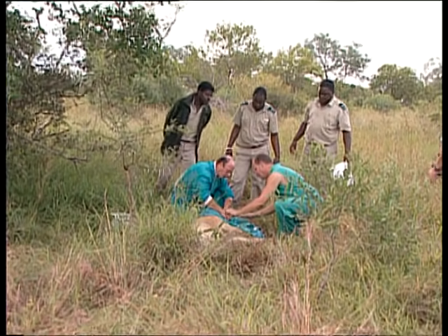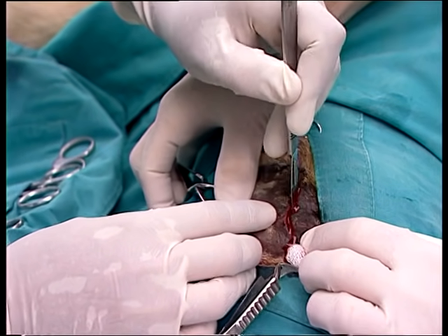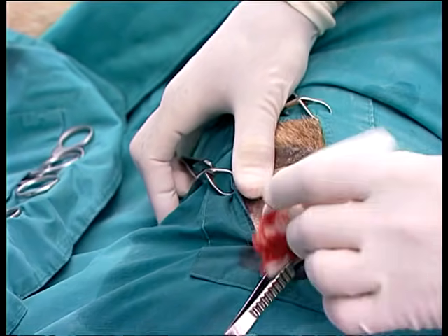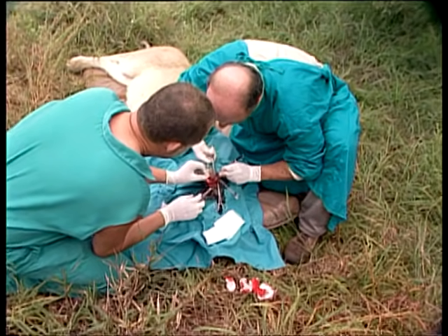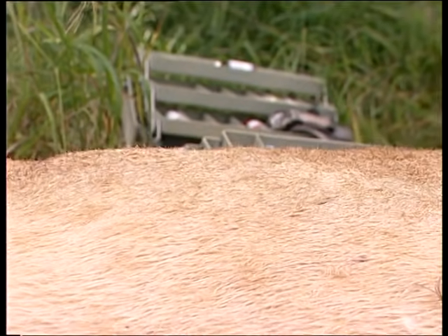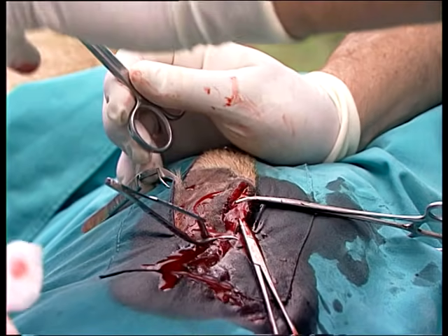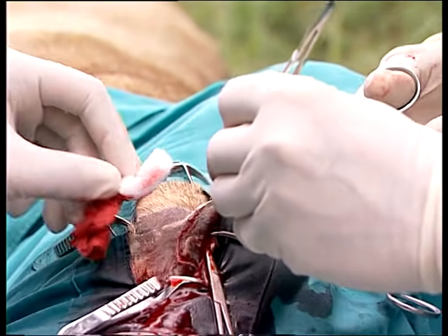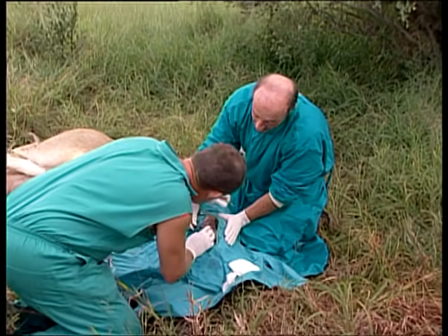Peter begins by cutting below the eye. That's through, I think. Okay. Our patient is fast asleep. I hope she really is asleep. I would cut just below, just on the zygomatic arch. Just here? Yeah. Let's just see how much skin we have to take. How far is this thing? It's going to take about 1 inch at least.